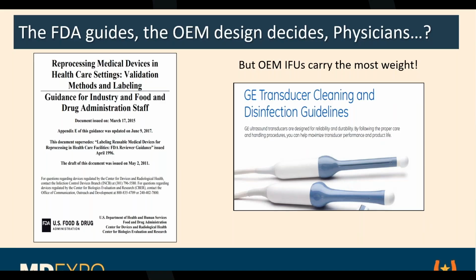That's entirely the responsibility of the companies that make the glutaraldehyde and other chemicals that are going to do that, and they have to demonstrate objective evidence that it kills it up to the level that the FDA requires for that particular indication for use. And then they go through a real long, laborious process of getting a 510(k) clearance for their products. So the automated device manufacturers also have to follow that stuff too. They have to work with the OEMs of the probes in demonstrating to the OEM that our automated device is not going to break anything either.